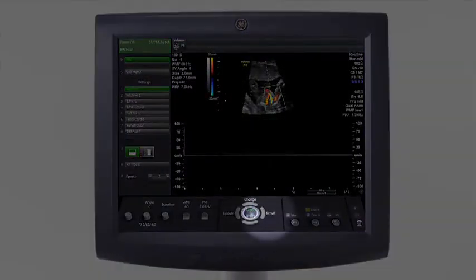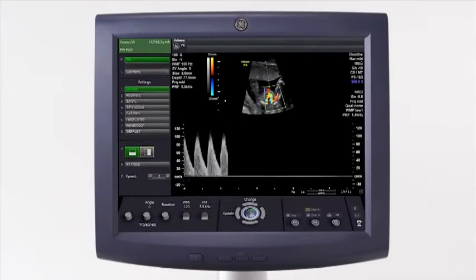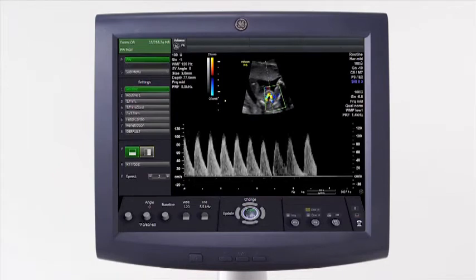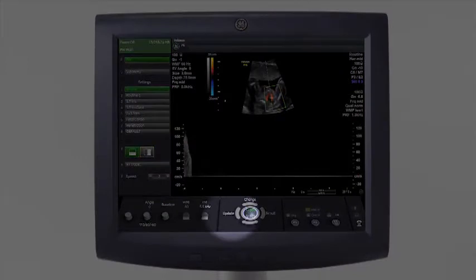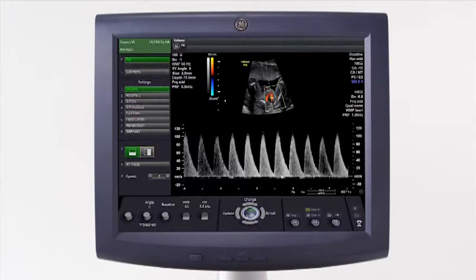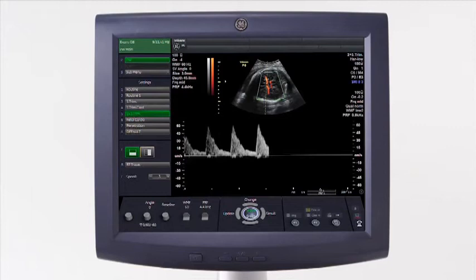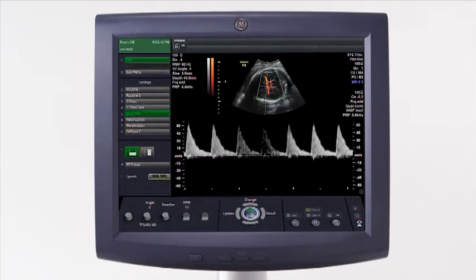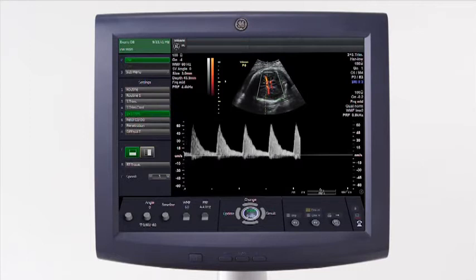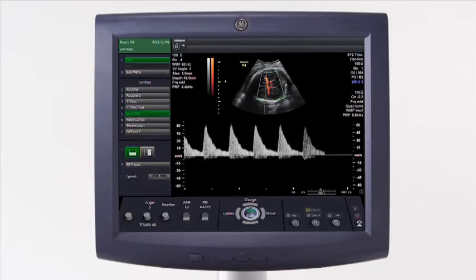Simultaneous allows B-mode, color, and pulsed wave Doppler modes to run simultaneously. However, the trade-off is that the quality of the spectrum is not as optimal since the system performs all tasks at once. Update mode freezes the B-mode and color Doppler modes to focus all of the system's processing power on the spectral waveform. If adjustment of the sample gate is needed, the system intuitively stops the spectrum and provides a live updated B-mode and color image so that the proper placement can be achieved. The system automatically goes back into the update mode once the trackball stops moving.